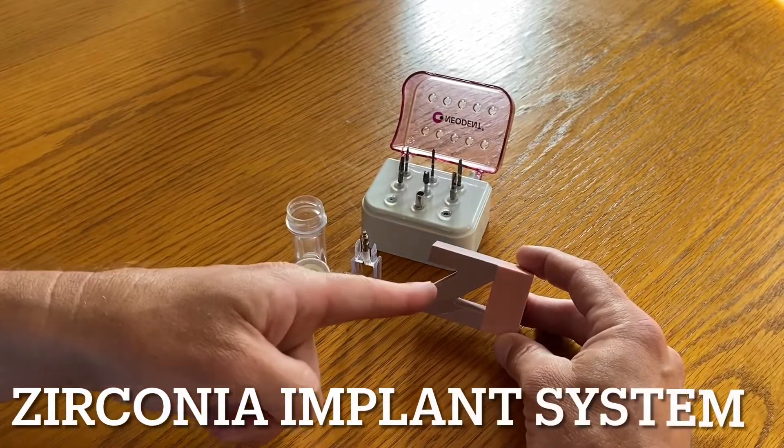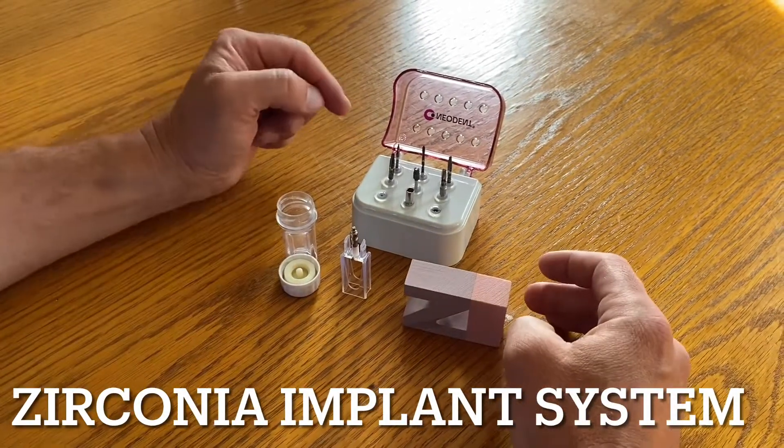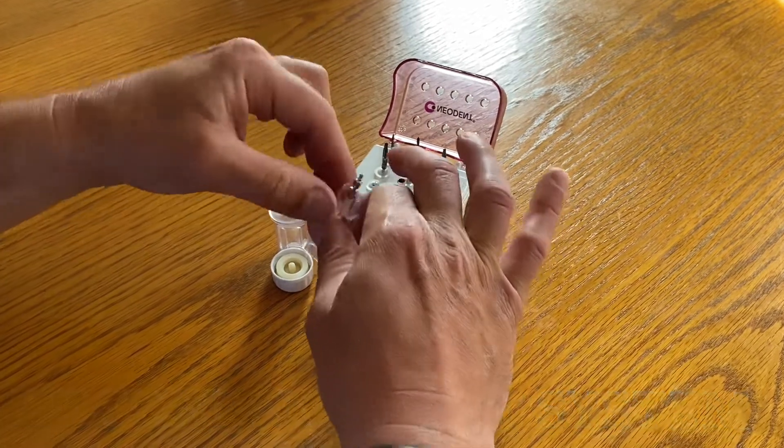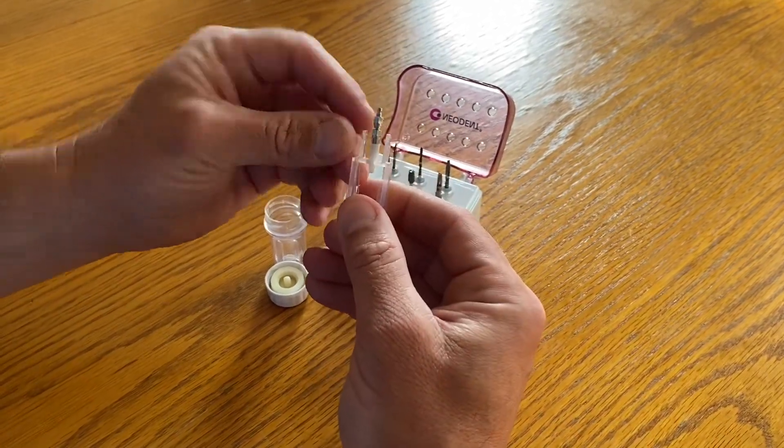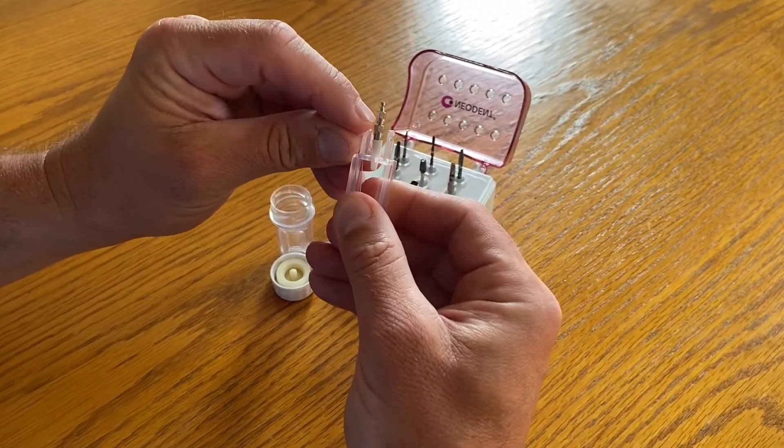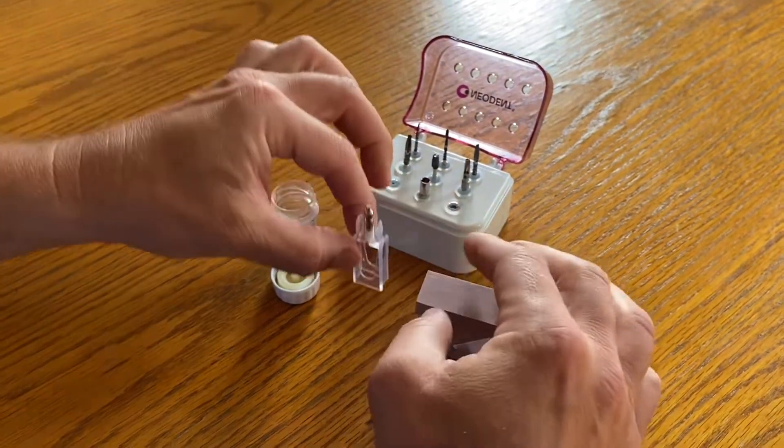This morning we're talking about the zirconia implant. It's a two-piece implant and it comes with a fixture mount so that when we insert the implant, if we exceed 50 newton centimeters, this is to snap off.